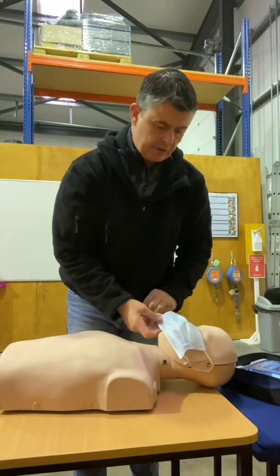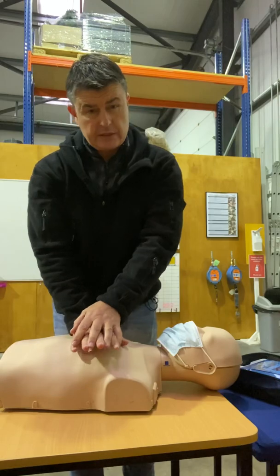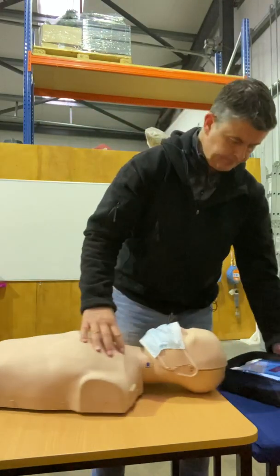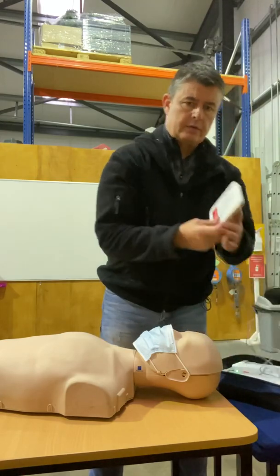During COVID, we're not teaching mouth-to-mouth as such — it's generally all compressions. Once you start, you just keep going. When the defib arrives, open up the defib and switch it on — adult patient.